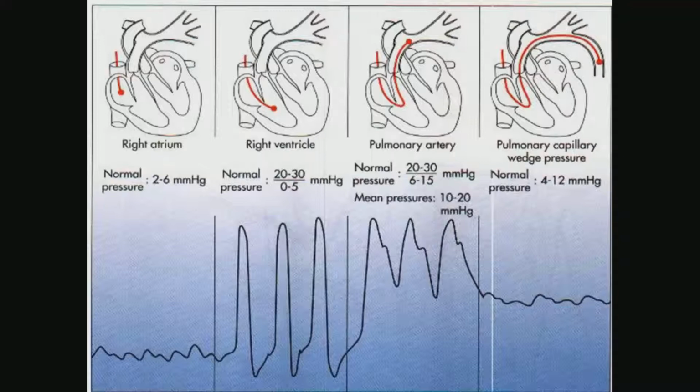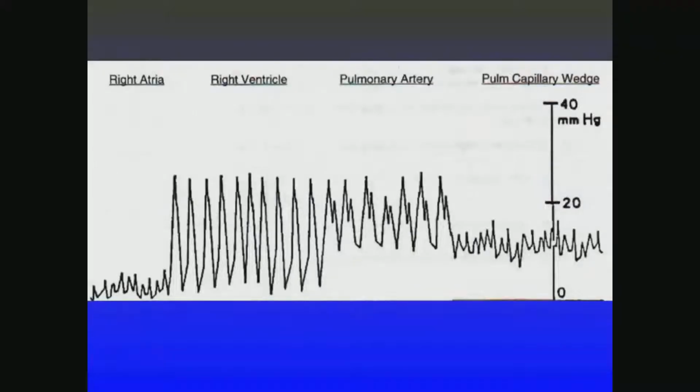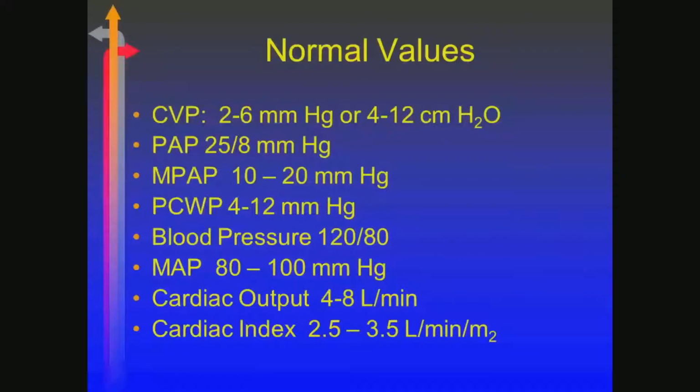On the order of 25/0. Once it passes into the pulmonary artery, the pulmonic valve closes, and you have a change in diastolic but no change in systolic, as well as the development of a dicrotic notch. And then when it's wedged, you get a wedge tracing with a value somewhere between 4 and 12 millimeters of mercury. And here's another picture of that same thing. Normal values are ones we've seen before, so it shouldn't be anything new, but I will provide normal values for you on the test.